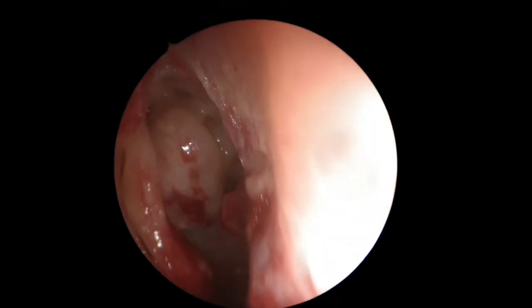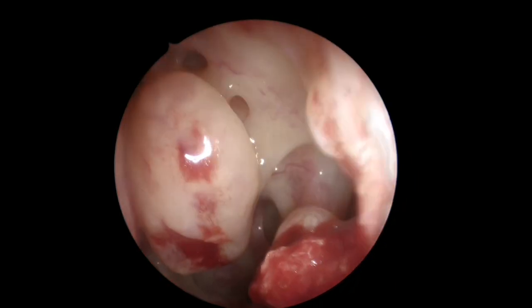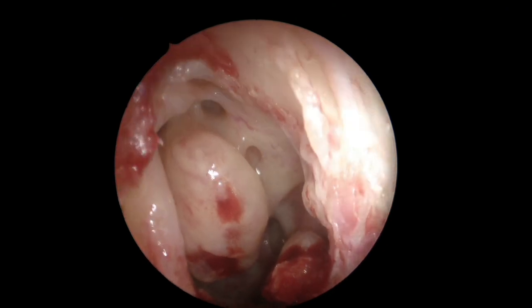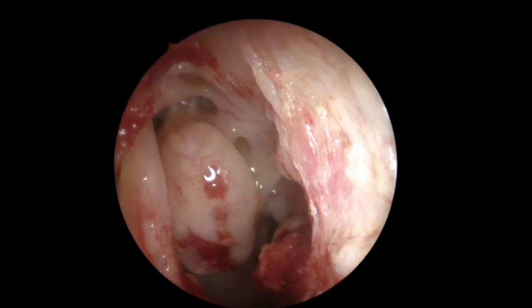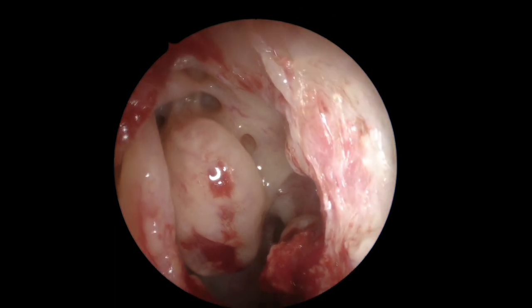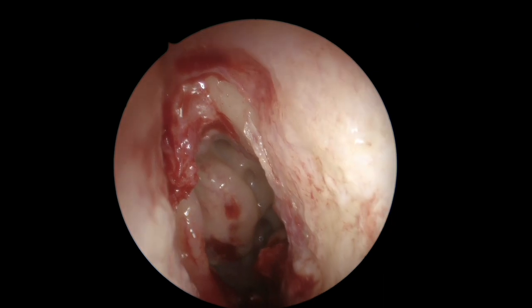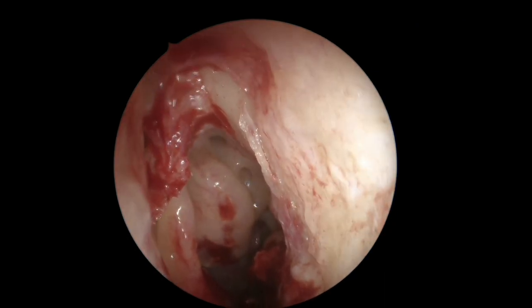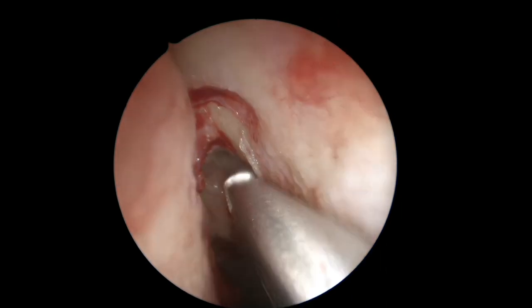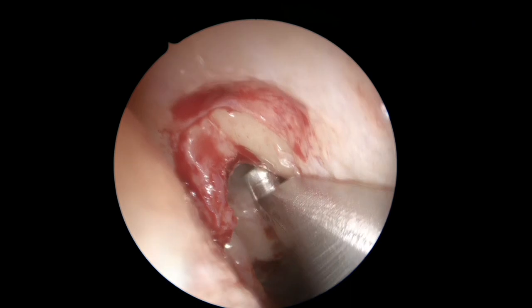The objective, as I've explained in many other videos, is to obtain a single sinus cavity just to allow corticosteroids to arrive there. You can see the bulla and some of the supra-bulla cells. Somewhere there you will find the frontal recess, and as you can see here, we expose with the debrider the ascending process — the frontal process of the maxillary bone.